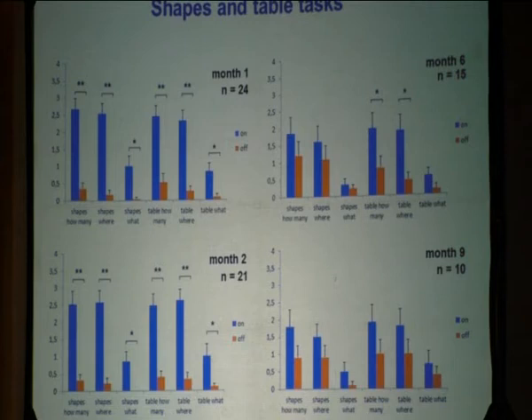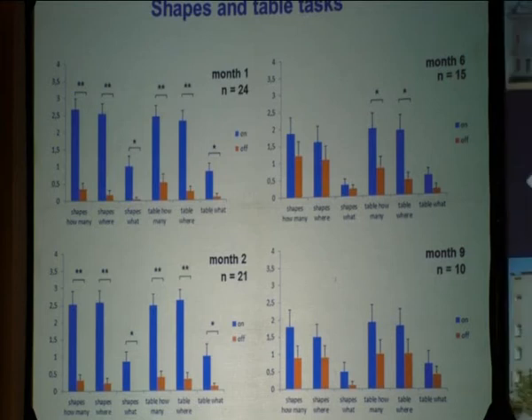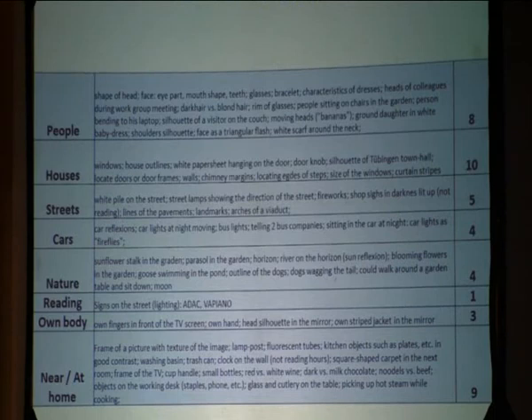For us, and that's the great problem, these devices do not last for a long time. Here you see the performance 1 month after implantation. The performance 9 months after implantation degrades very much. So it is really a great problem to passivate such an implant so that it lasts over time. So far, we think we can make an implant that will live for about 5 years, but at the moment not longer. These types we had now were for just a year, but no longer than that. So that's what the patients report to us.